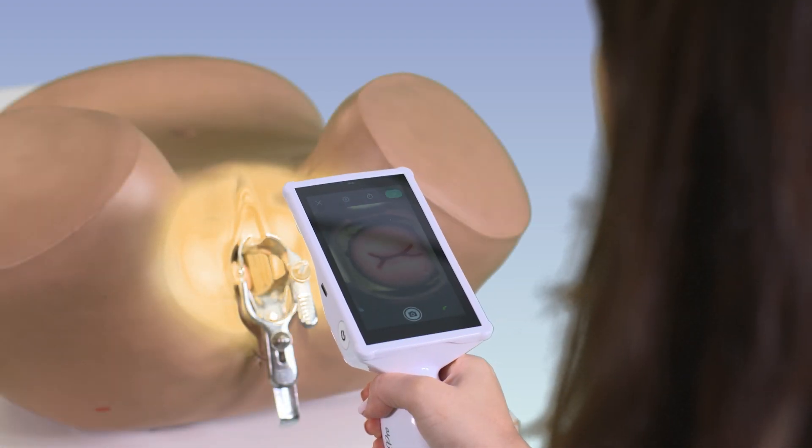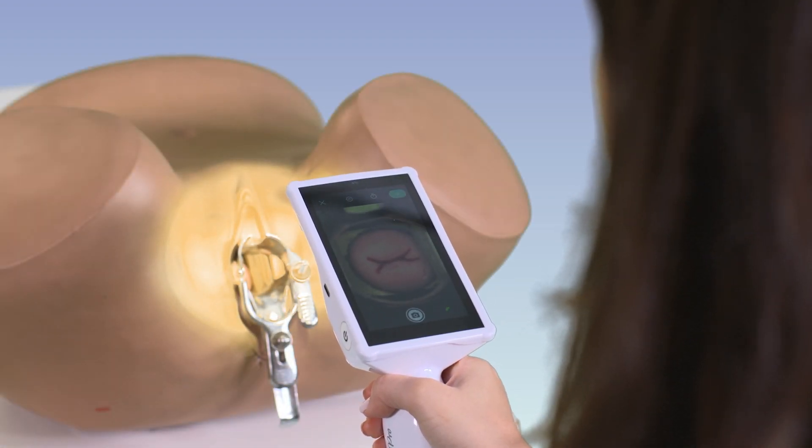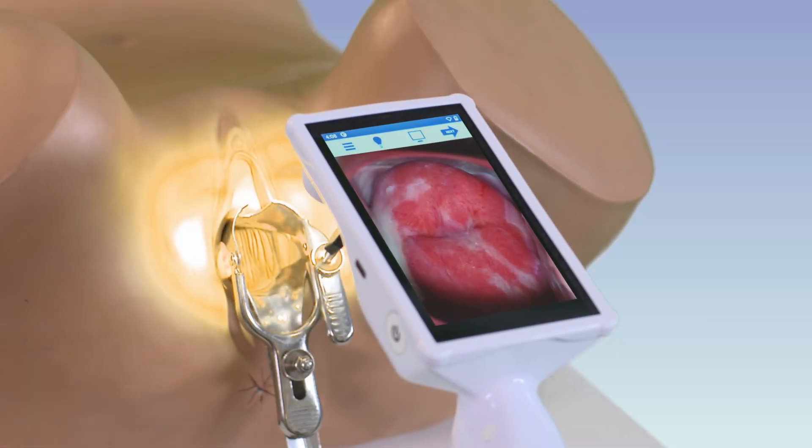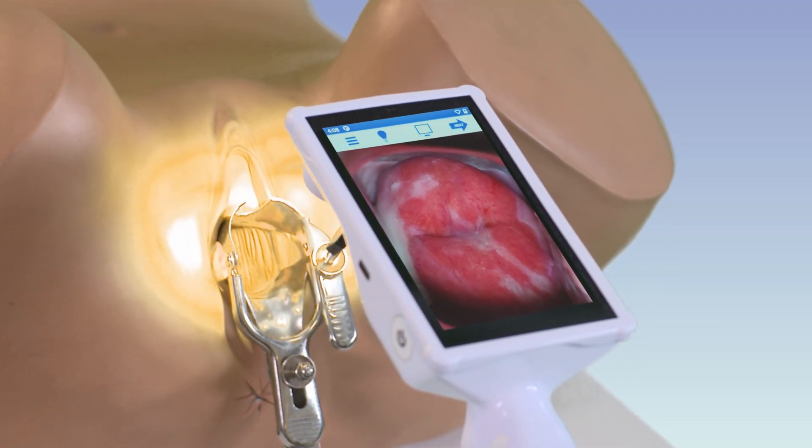For optimal image quality, make sure the center of the camera is aligned with the center of the cervix. The cervix should be fully illuminated and without glare.